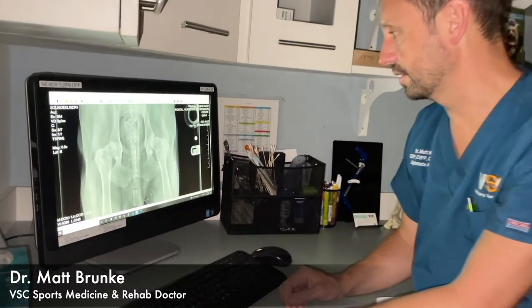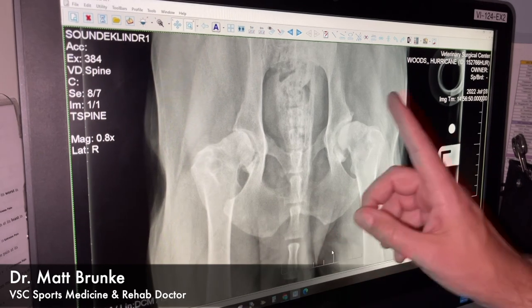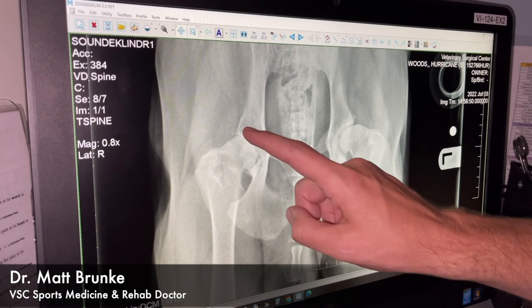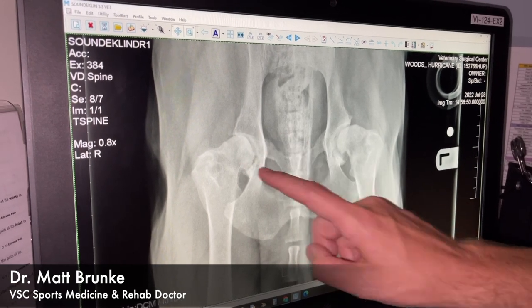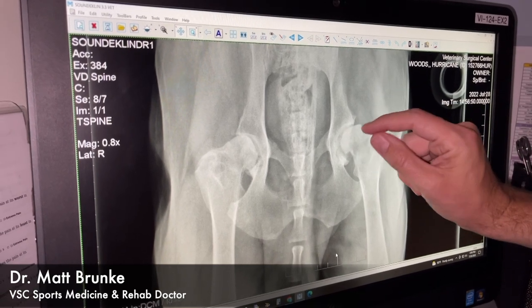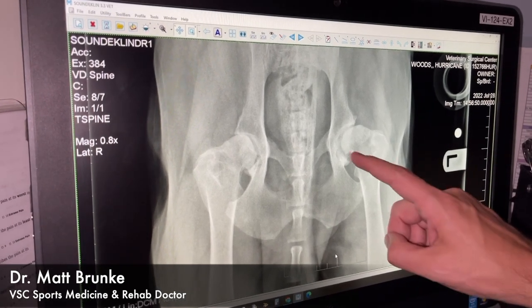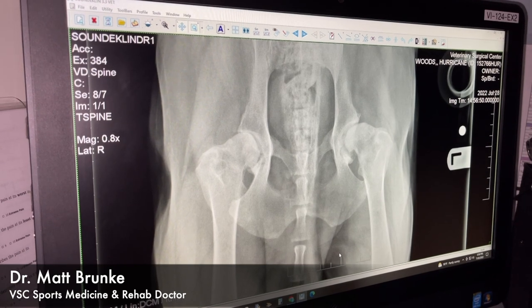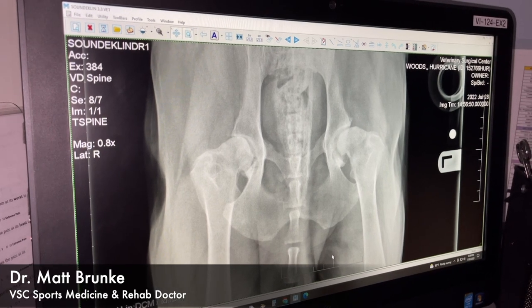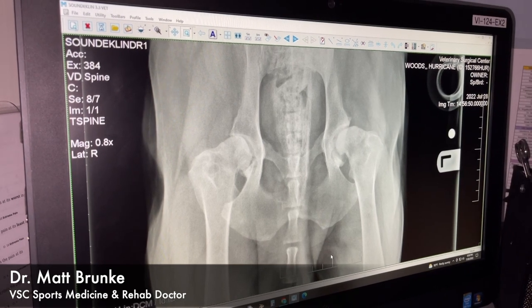Now we're looking at x-rays of Hurricane's hip joints. His right hip is on the left side of your screen and the left is on the right. He's a little arthritic on the right side, but the ball is pretty deeply seated into the cup. On his left side, it's shallower and getting pinched with arthritis — we're probably getting towards bone-on-bone or at least a lot of cartilage loss. We don't see anything eating away the bone, so we're not worried about infection or cancer. Our next step is to put a camera into his hip joint to see what the cartilage looks like.